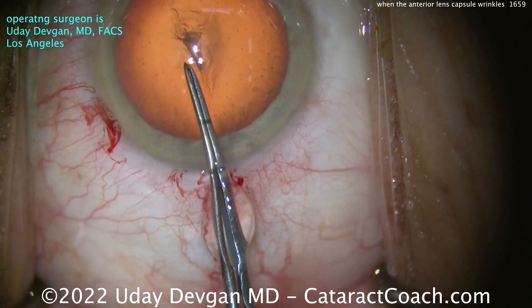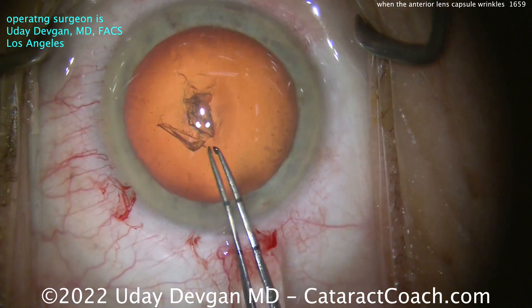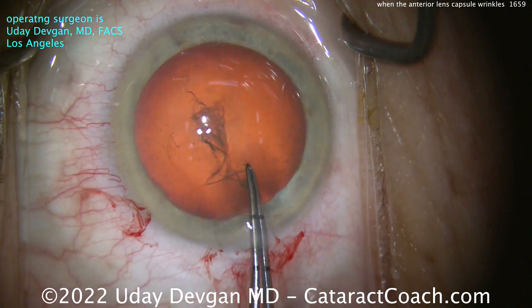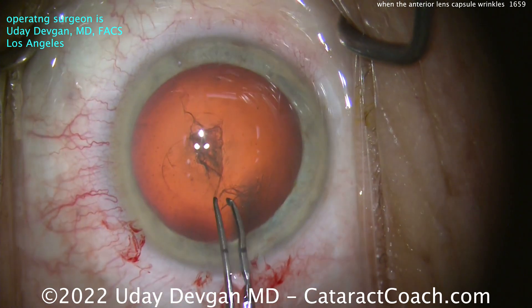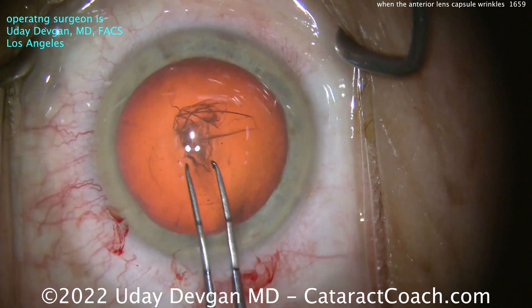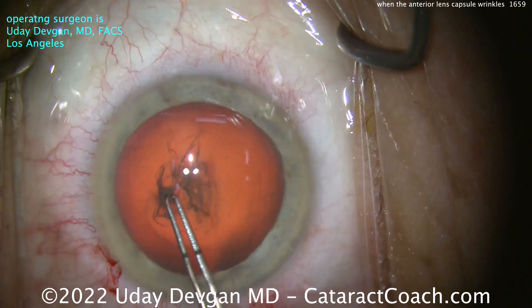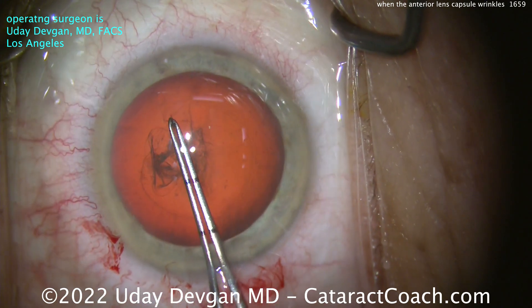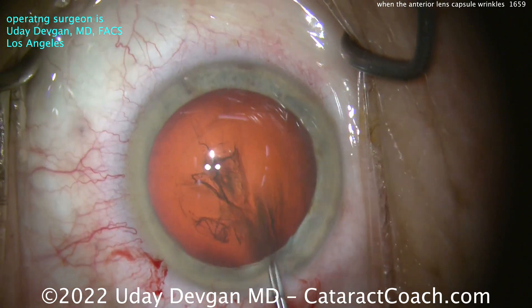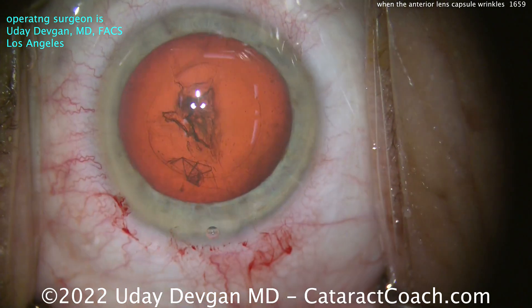Now I'm going to watch very carefully as I tear the capsule. Is there zonular weakness? Do I see more wrinkling? At this point, not really. I measure out in my mind what's a 5mm rhexis. We'll complete the rhexis and it all goes pretty normally. Maybe just a little bit of zonular laxity — it was global, not focal, no prior trauma, not one quadrant that was very weak. So the rhexis is completed: definitely 5mm diameter, well-centered, and looks pretty good.